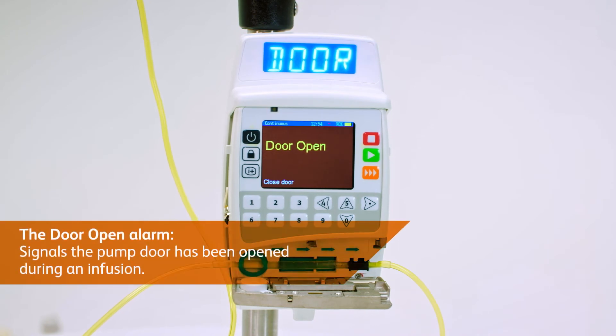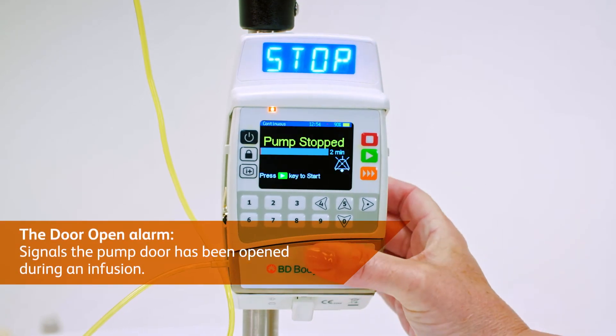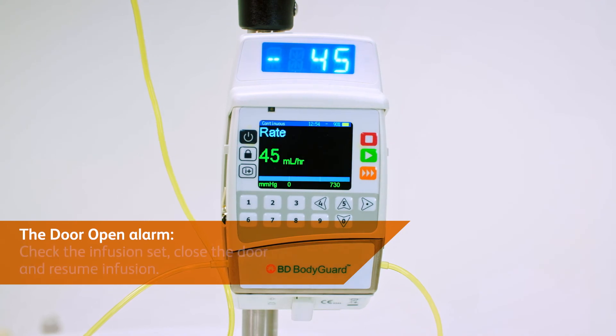The door open alarm warns that the pump door has been opened during an infusion. Check the infusion set, close the door and resume infusion.